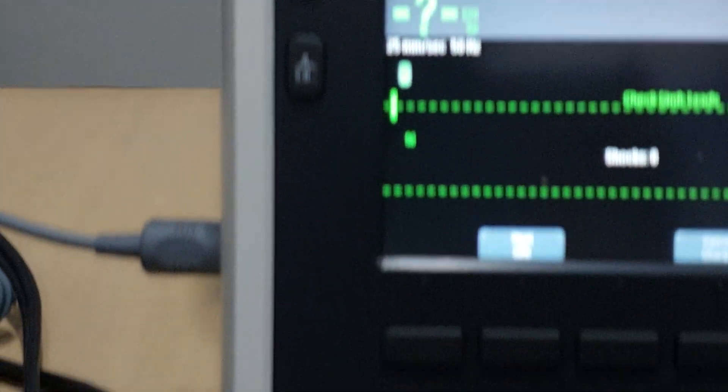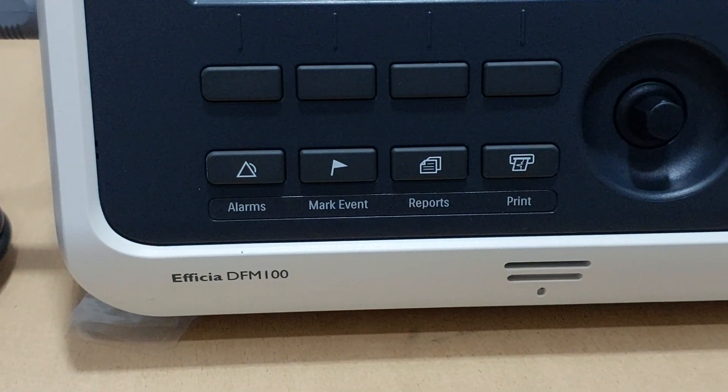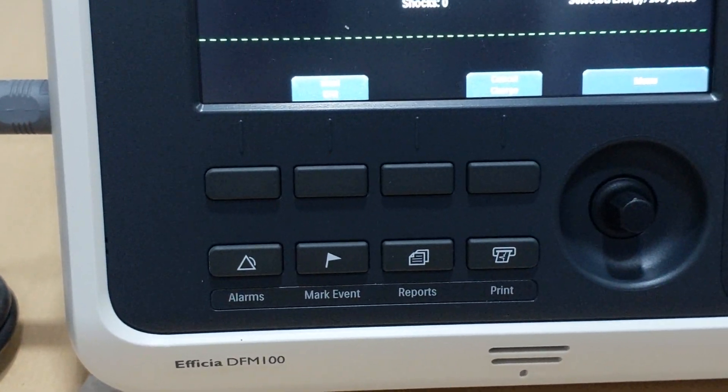These are the alarm controls. This button is for event marking, this one is for the report, and this is for printing. So this is basically everything regarding the DFM 100. Thank you.